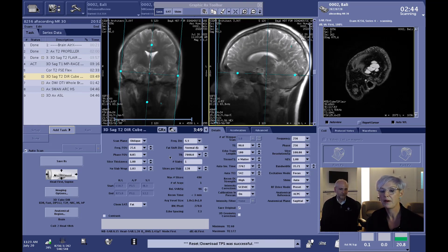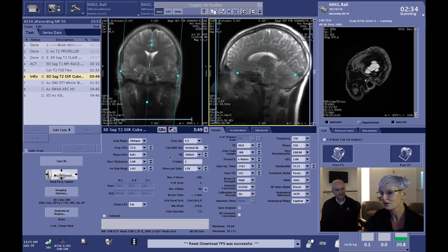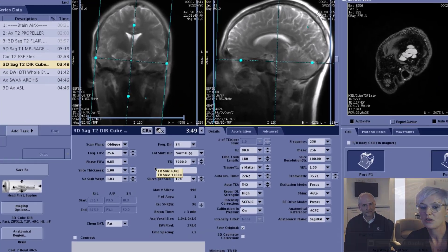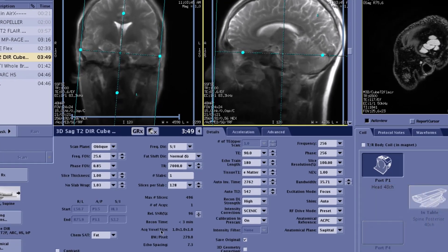Another huge example where Air Recon DL is beneficial is for our Cube DIR sequence, because that sequence by nature has very little signal — we are suppressing fat, suppressing white matter, and on top of that suppressing fluid. So it's hard to get signal out of the patient, and I would never get a pixel size around a millimeter before Air Recon DL. With Air Recon DL, I can suppress the tissue and achieve a scan time of 3 minutes and 49 seconds.